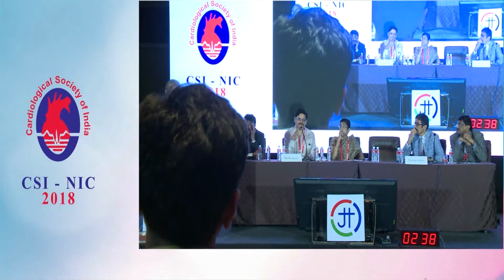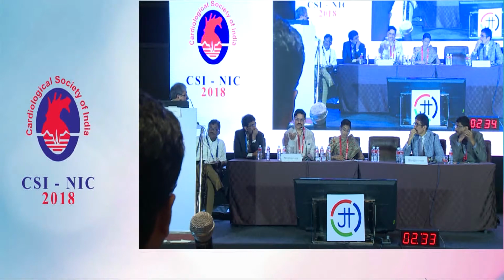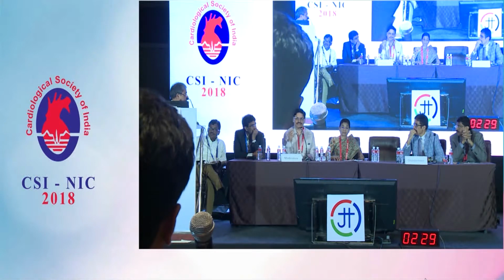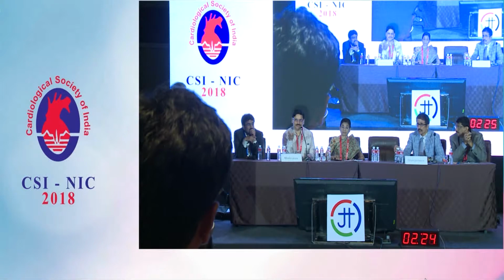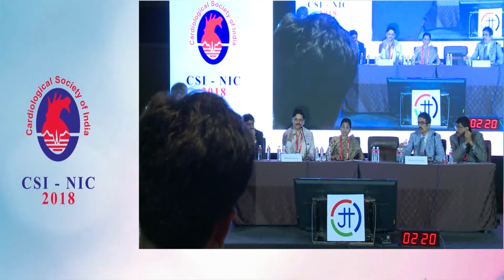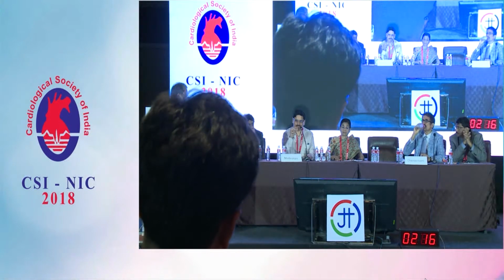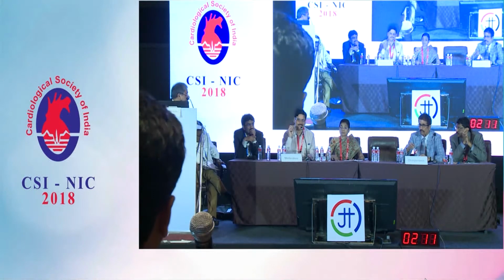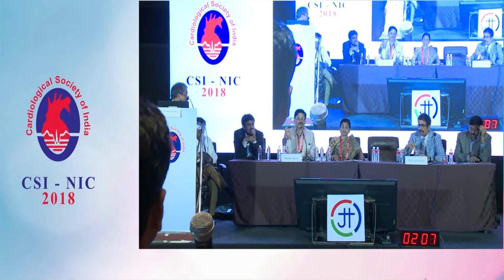The situation here is whether it is due to the no-flow phenomenon or dissection, we do not know, because he dilated the balloon, we do not know what was happening because of no flow. That's why in chronic total occlusion we do the same technique. Once it passes, whether it is a true lumen or whether debris has become embolized, then you can give this injection. Then the vessel architecture will be clearly delineated, it is easy actually.